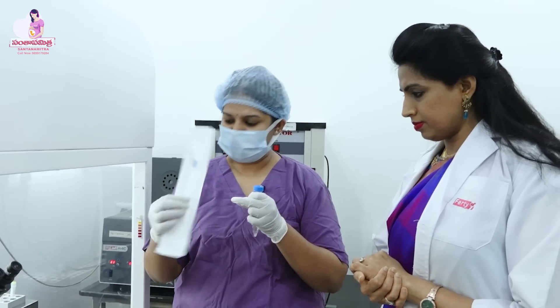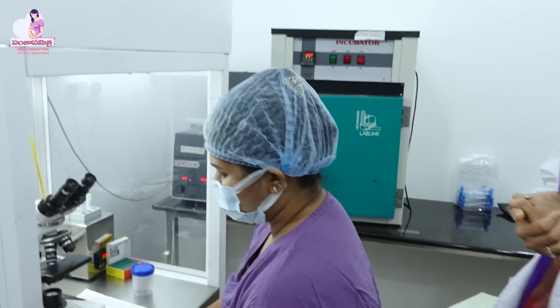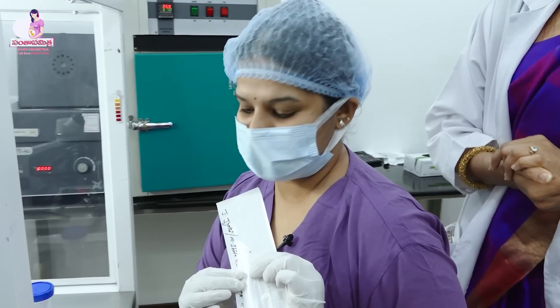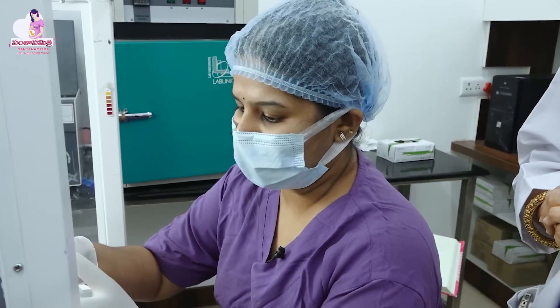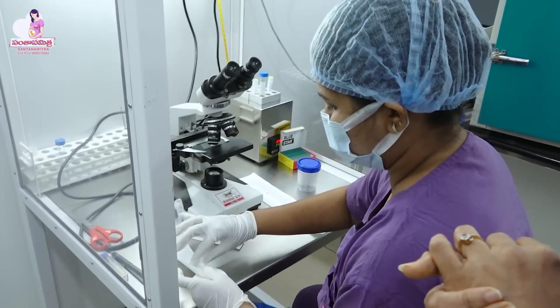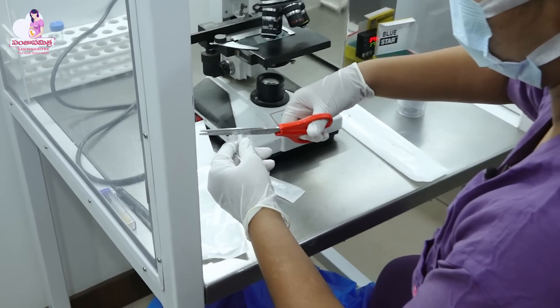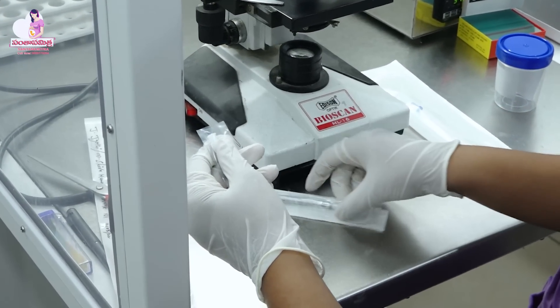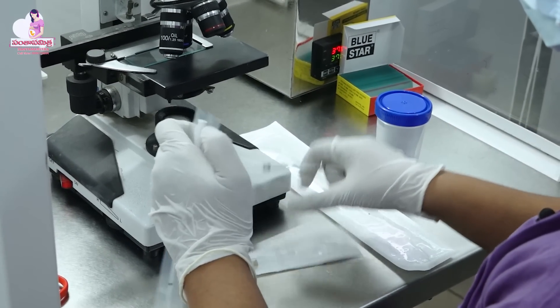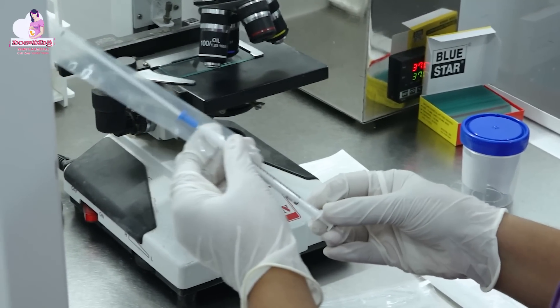This is the IUI catheter. I will show you the loading process. I am opening the catheter. We are going to load it with the use of a 1 ml BD syringe.